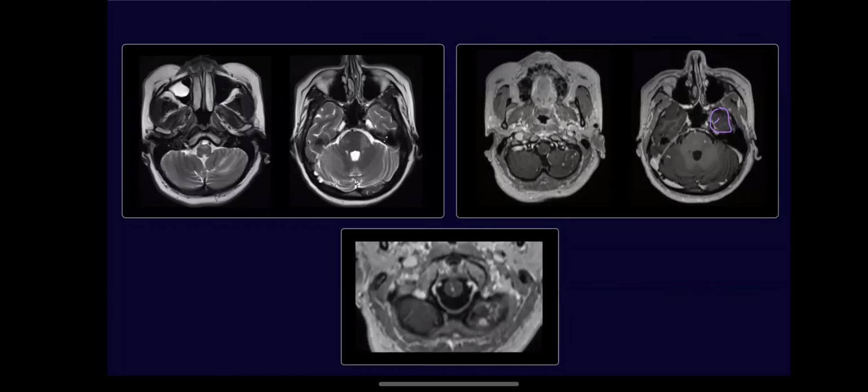He had some bulbar symptoms and there was ataxia. So we looked at the brain and we thought, okay, there's involvement of the cerebellum, there's involvement of the brainstem. So we know it's sort of matching with the clinical picture. The onset, of course, here was over a couple of weeks. And we got the post-contrast imaging. And of course, we saw enhancement in the areas that showed involvement on the T2 weighted images.